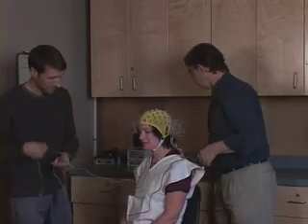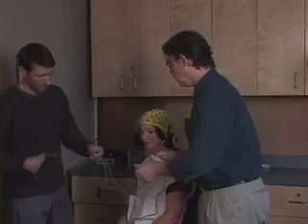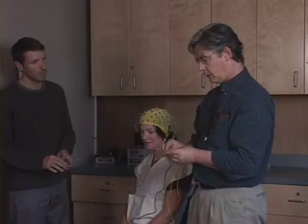Now, with the galvanic skin response, we have to attach those to Kate's hand. Now, Kate, are you left-handed or right-handed? Right-handed. Now, because Kate is right-handed, we will attach this to her left hand. And so what we have here are two little sensors that will induce a very small current through Kate's skin to give us a measure of the skin response. So it'd be about the equivalent of putting your fingers on top of the leads of a 9-volt battery. Almost completely unnoticeable.